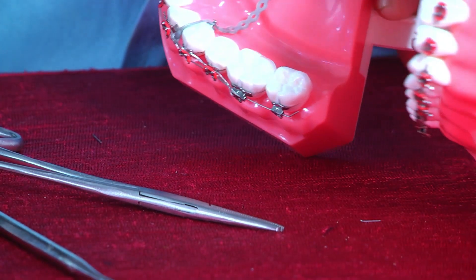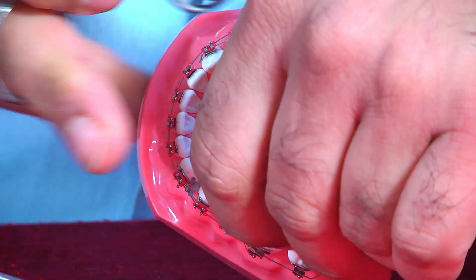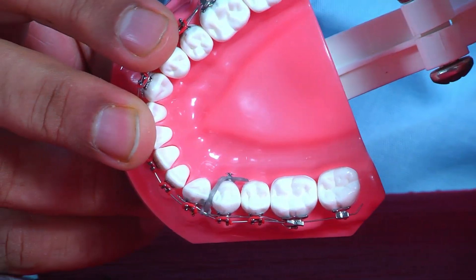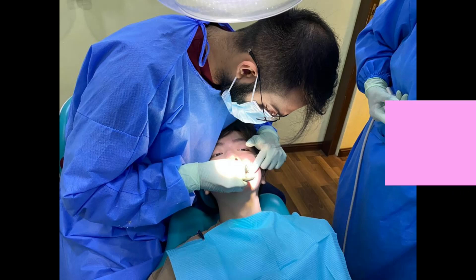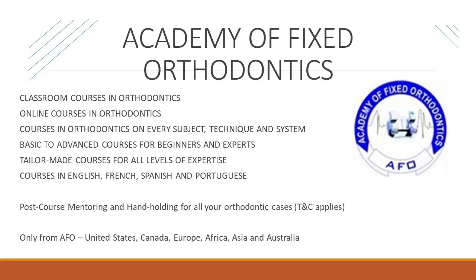Now cut off the excess. The thickness is coming from here — this is how you leave it there. There you go.